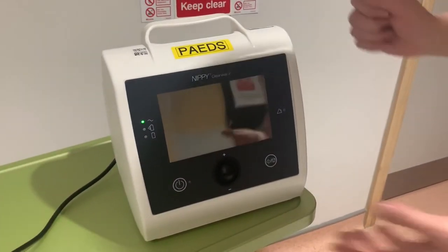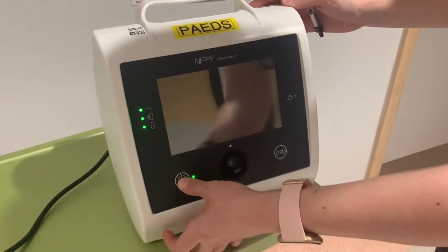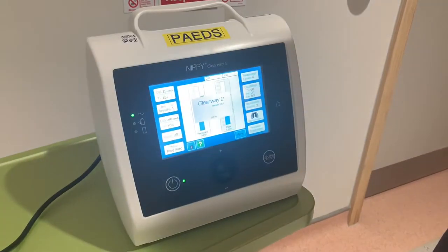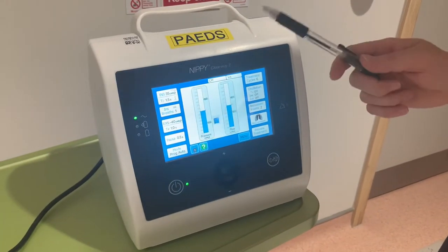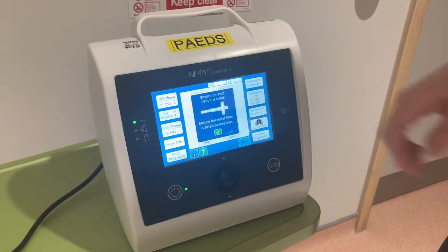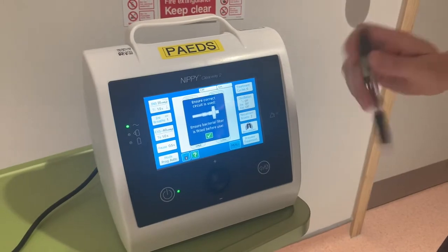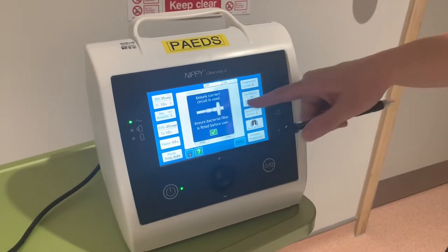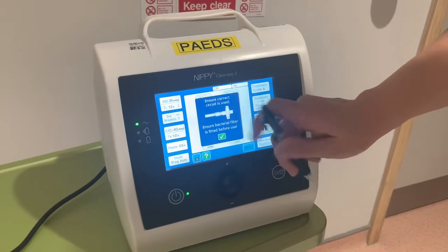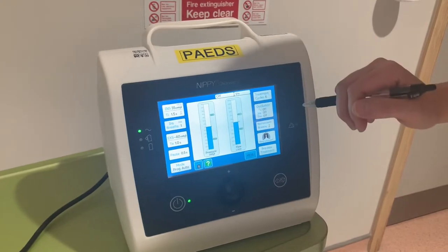We're starting to use the Clearway 2. I've plugged it into the wall — it has a nice big on button. Like the old Clearway, it comes on with the previous settings that were last used. Every time you turn it on or change your settings, a box comes up asking if you've got the right circuit — just press the tick button. Sometimes the touchscreen is a bit sensitive, so a pen can be better.